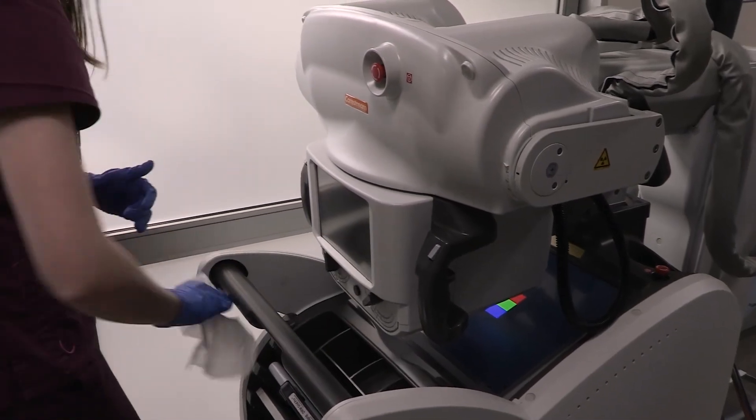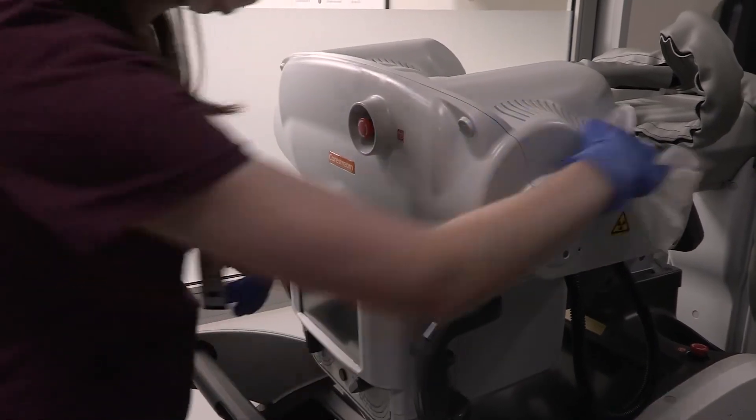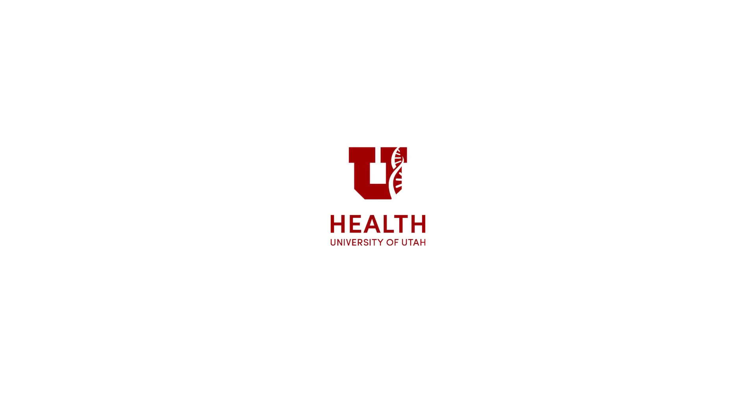Our hope is that through this modified chest radiograph technique, we can keep our healthcare staff safe and continue to provide high-value patient care at the University of Utah Healthcare System.